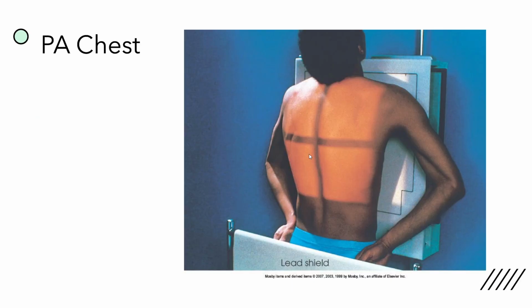If we were to shield, we could shield around the gonadal region. But like I said before, generally that's not something that's really indicated anymore.